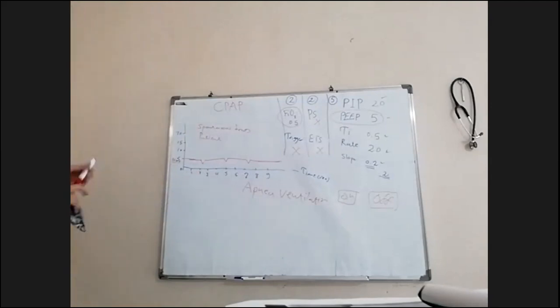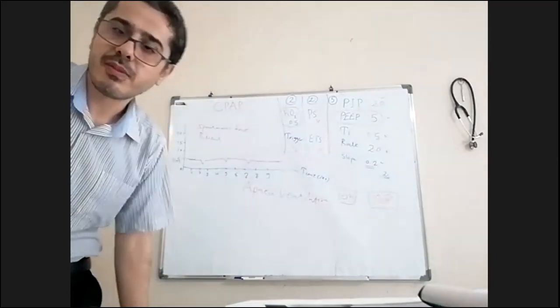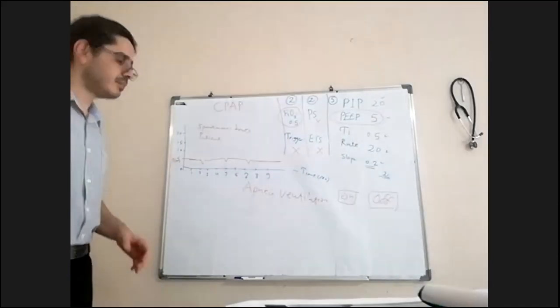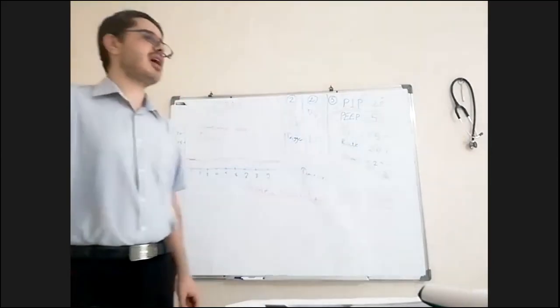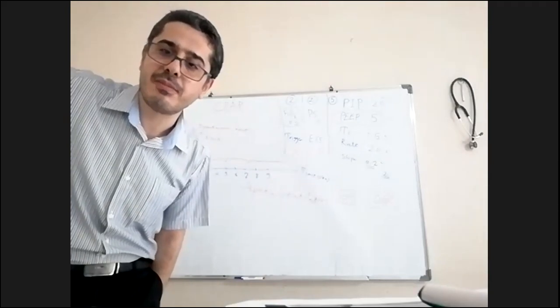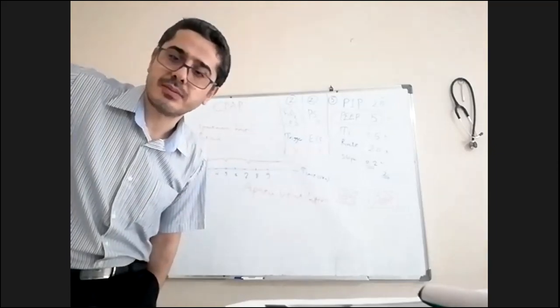So no invasive CPAP, right? CPAP can be non-invasive and can be invasive, depending on the interface which you use. Invasive CPAP can be used at the last stage during weaning. When we wean the patient, at the last stage before extubation, you can keep the patient on CPAP and see if there is spontaneous breathing, and then we can turn off the ventilator.